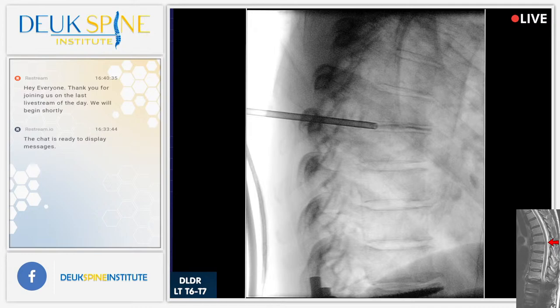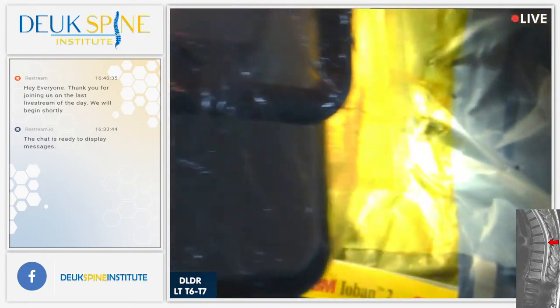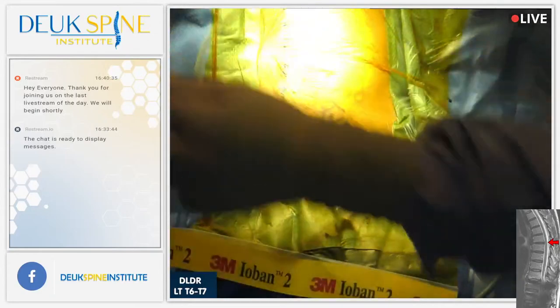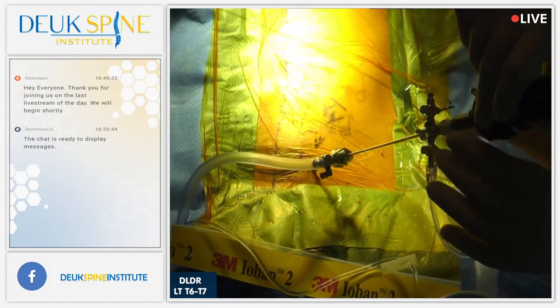At this point, we're going to bring the endoscope in, and we're going to finish the surgery endoscopically with a laser. This is called the Deuk laser disc repair. It's done endoscopically. This is, of course, outpatient. This patient goes home in about an hour from now. All right. Lay still.